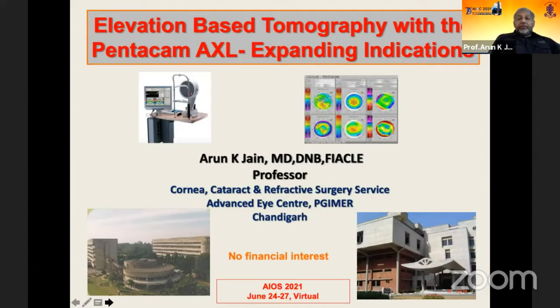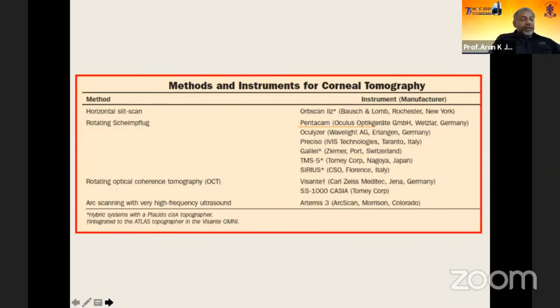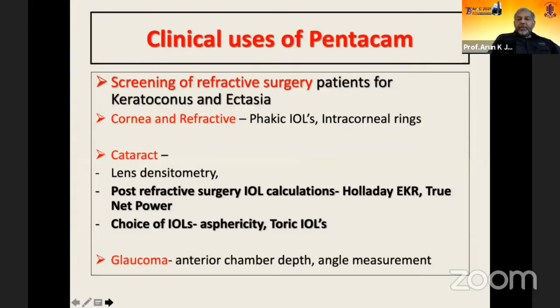I have no financial interest in the subject matter of this talk. As you all know, there are so many instruments available in the market which give us tomography, but today I'll be emphasizing only on Pentacam. These are the various clinical uses of Pentacam, and I will be emphasizing mainly screening for refractive surgery. If time permits, we will talk a little bit about post-refractive surgery IOL power calculation, as well as the role of Pentacam in choosing aspheric and toric IOLs.